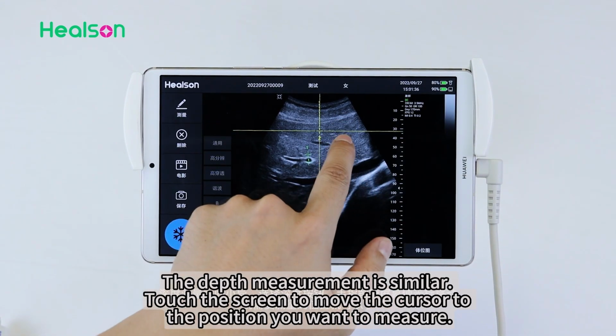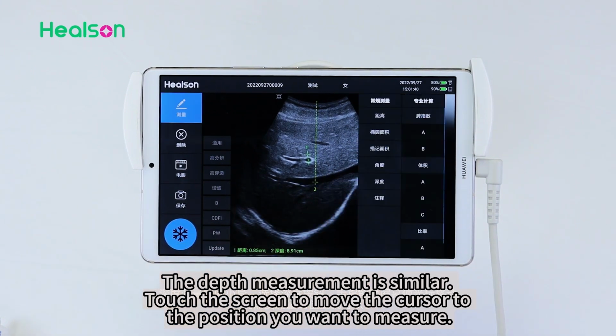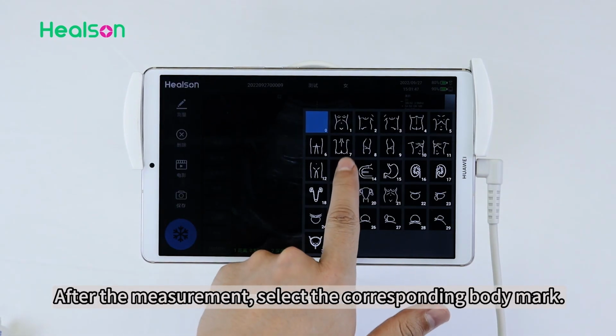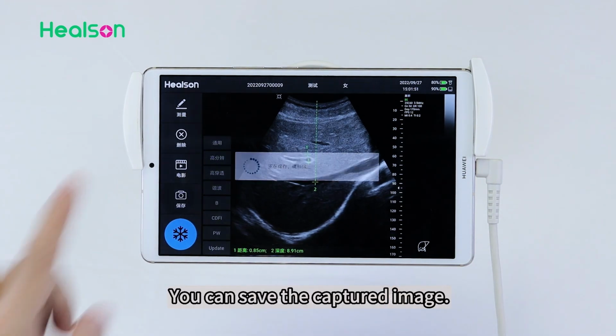The depth measurement is similar. Touch the screen to move the cursor to the position you want to measure. The measurement data are displayed on the bottom in turn. After the measurement, select the corresponding body mark. You can save the captured image.